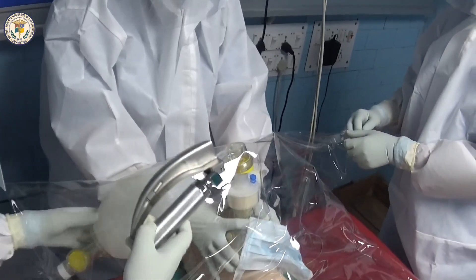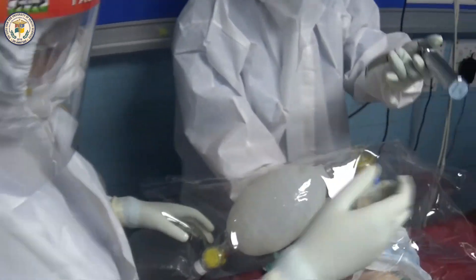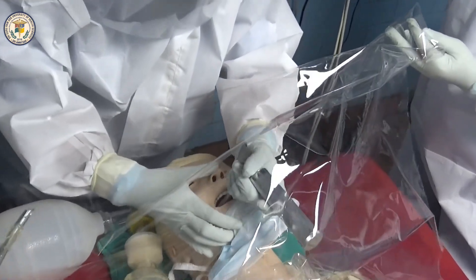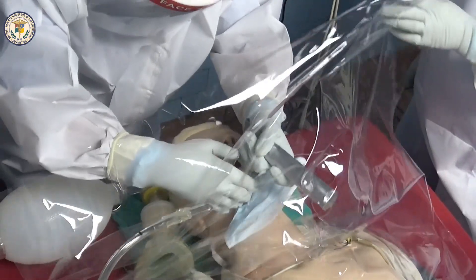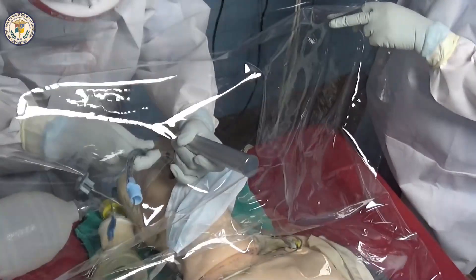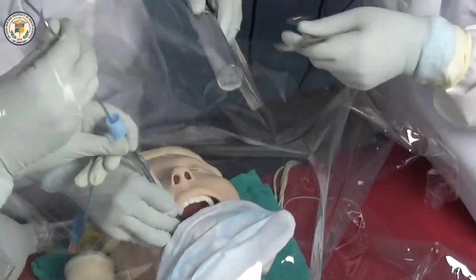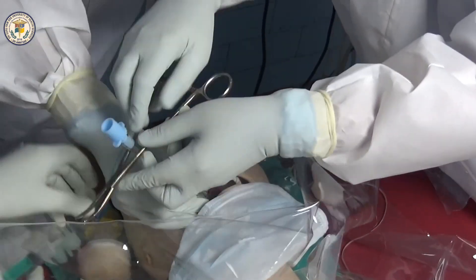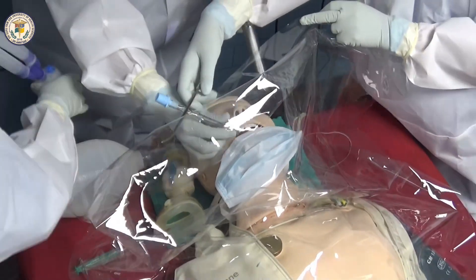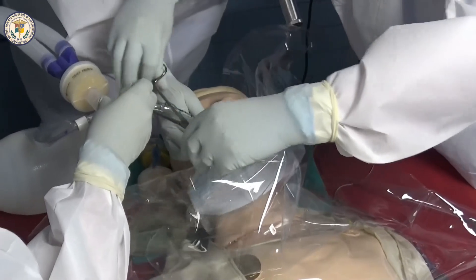Turn off oxygen flows before removing the mask. Perform direct laryngoscopy and pass the endotracheal tube under vision; a video laryngoscope would be preferred if available. Remove the stylet, apply the clamp, and inflate the cuff. Applying the clamp minimizes aerosol spread. De-clamp only when the HME filter and breathing circuit are connected.